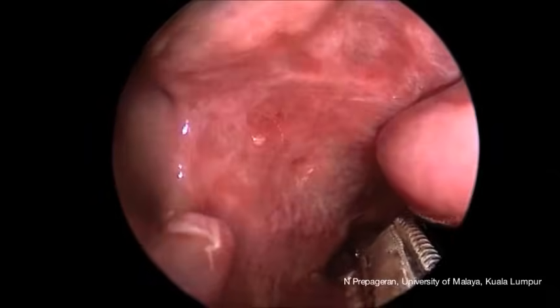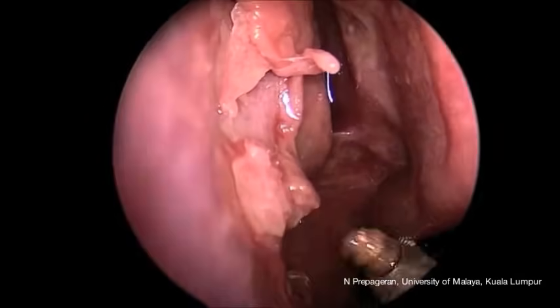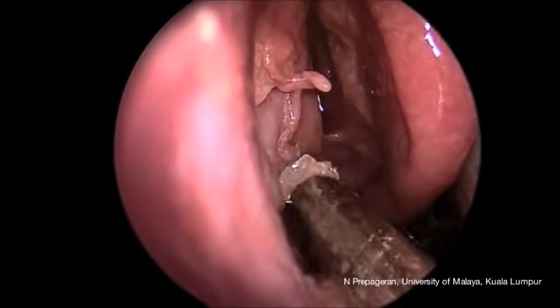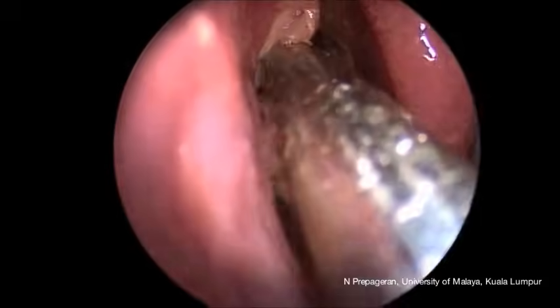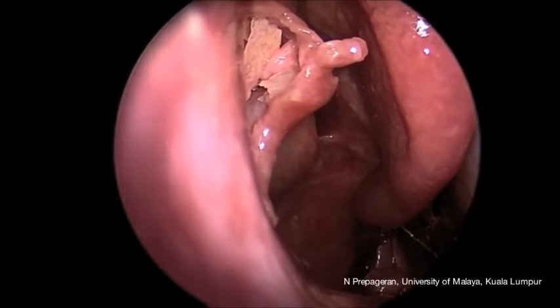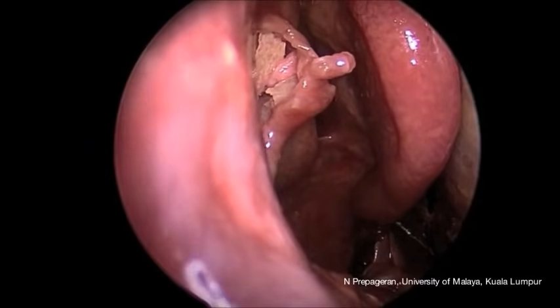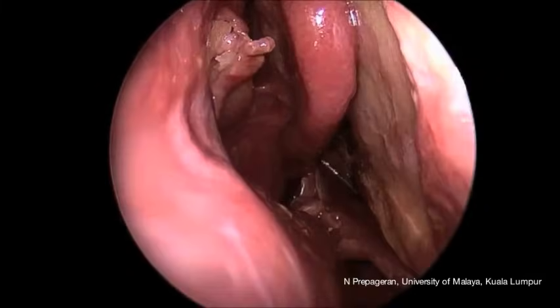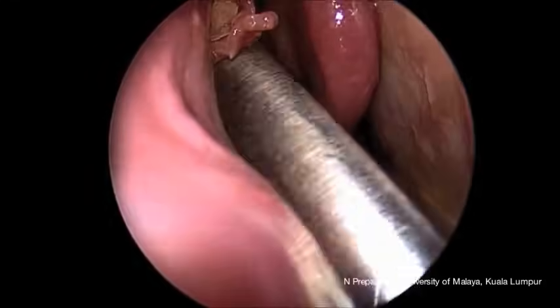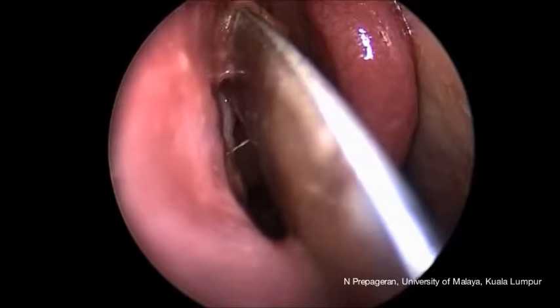You want to remove the inferior portion of the uncinate process as cleanly and as much as you can, because once you remove the inferior portion of the uncinate process you'll be able to have a good look at the maxillary ostia. Subsequently you can remove the remaining part of the uncinate process, and in this case because the bone has been removed previously there's only the mucosa of the blind sac left, which we are going to remove now using forceps.